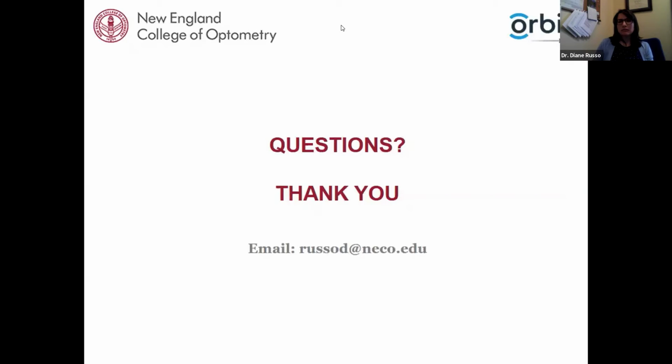I can't say definitively beyond what I explained in the beginning of the lecture, which is it's giving you an estimate of what your best corrected vision should be. And so it may not be exact. So if your pinhole is 20/25, but you're only able to get the patient to 20/30, that happens very commonly, so it won't be exact.